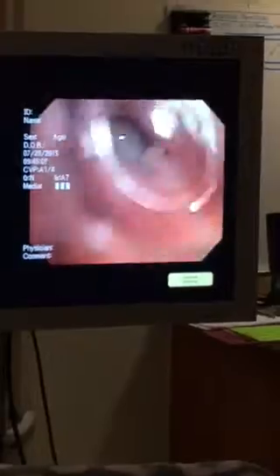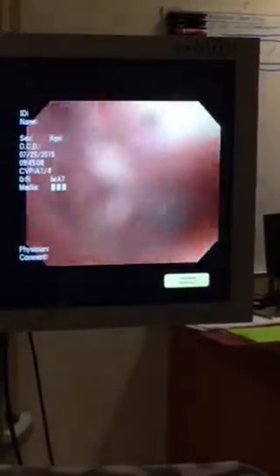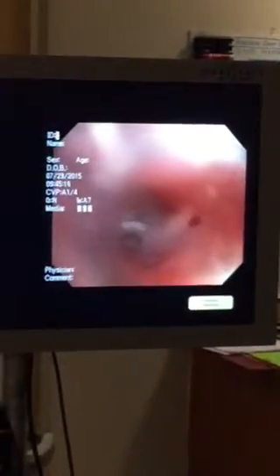You can see there's a lot of pus. Let's go ahead and lavage this area. Is this your right lower? Yeah. No, this is left lower. You're doing the left lower? This is one of the, remember that area I was showing you that was all matted up and kind of toward the lower middle? Yep. Oh, what's going on? On the left side. This is the area I'm in now. Left lower lobe.